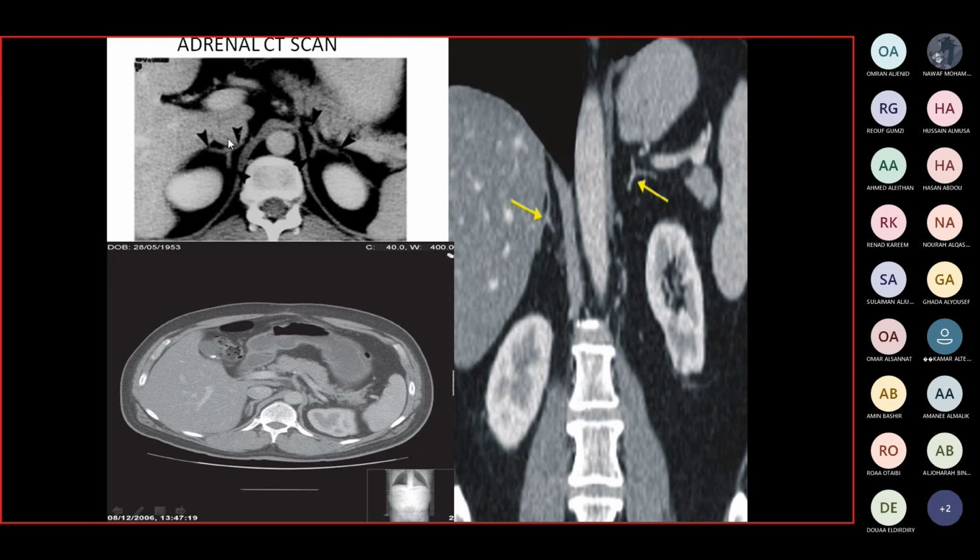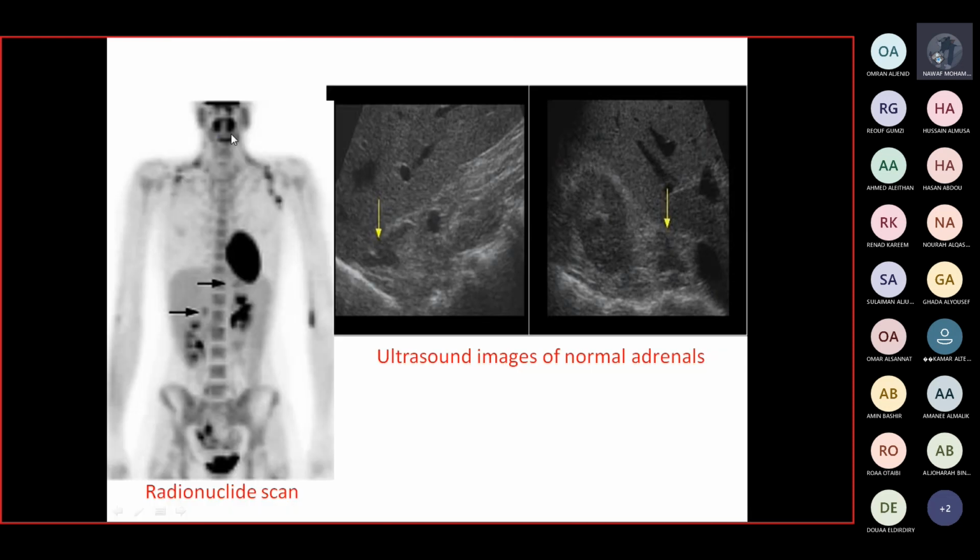The right adrenal gland is, what is this structure? Pancreas. I think, if it's behind it, maybe it's part of the diaphragm. What is this? Aorta. And what is this? Inferior vena cava? Yes, this is the inferior vena cava. You are right, thank you.